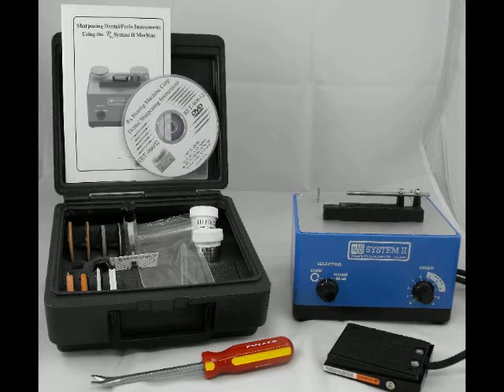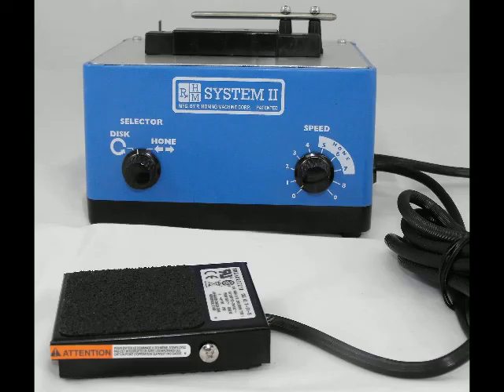The set you see on the screen is the Perio set. Carefully look over what is involved with the Perio set. If you see anything missing between this set and your set, please give us a call at the 800 number at the end of this video.